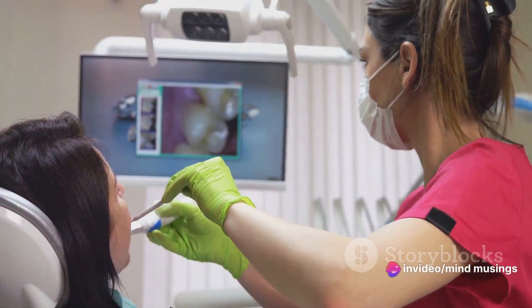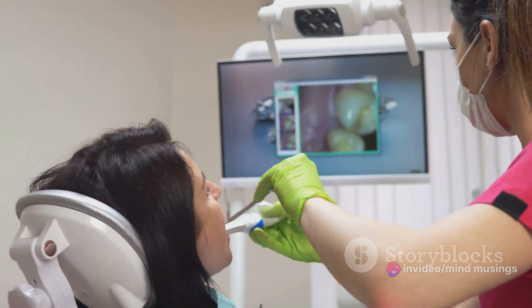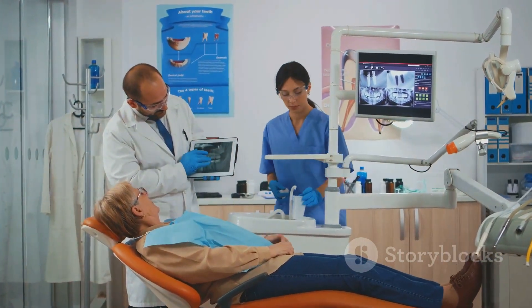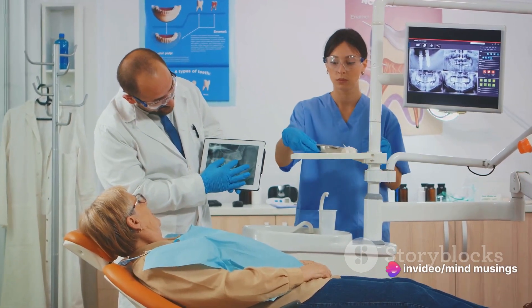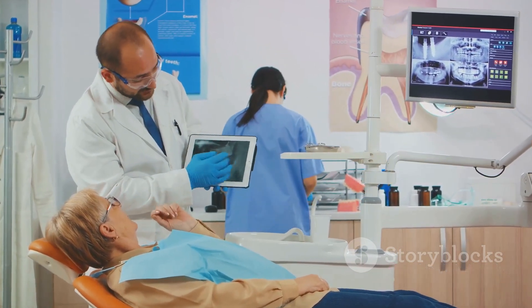An intraoral camera, as the name suggests, is a small handheld device that takes high-resolution images within the mouth. It resembles an oversized pen and has a disposable protective sheath for hygiene purposes. This camera displays a live video feed onto a monitor, allowing your dentist to view the teeth, gums, and mouth from different angles in real time.